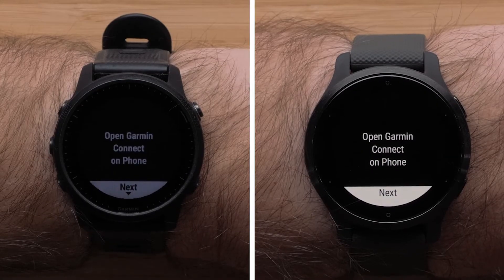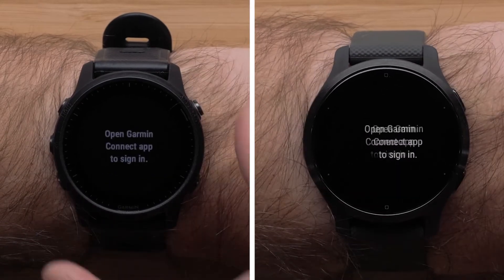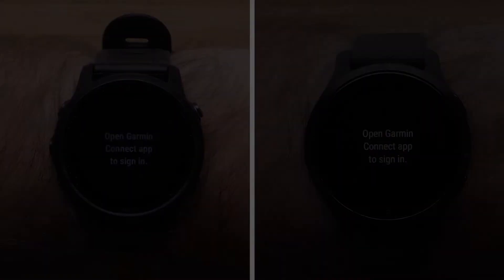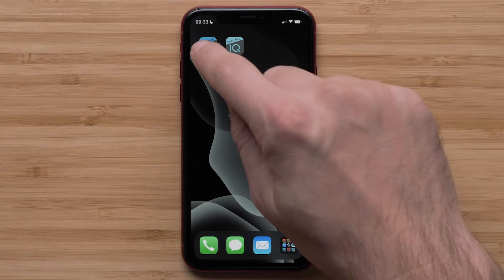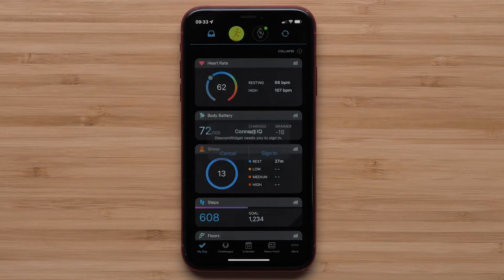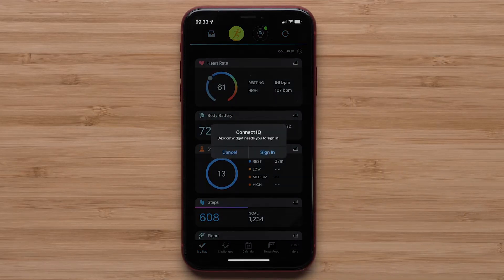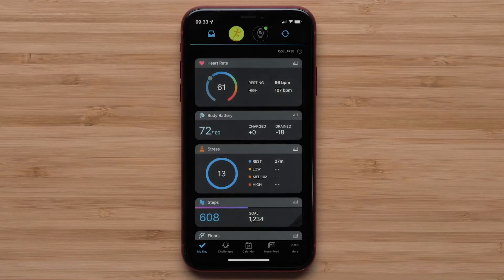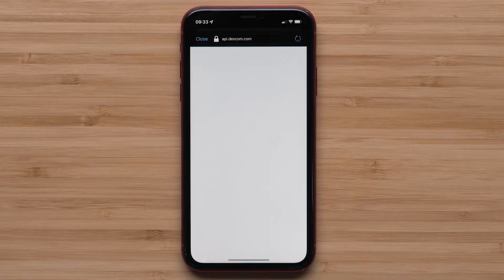When prompted, open the Garmin Connect app on your smartphone. Android phones will automatically open the Dexcom sign-in page. If you are using an Apple iPhone, select Sign In on the login prompt.